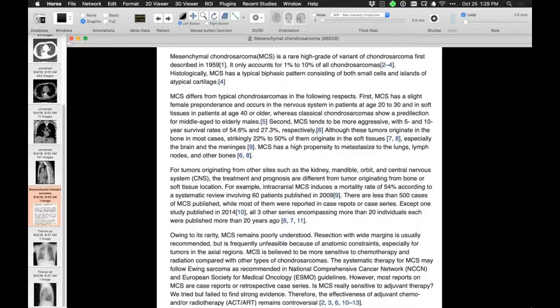A lesion that has calcified and/or ossified matrix, certainly consistent with costal cartilage matrix in a very aggressive lesion. This turns out to be a mesenchymal chondrosarcoma. We've certainly seen chondrosarcomas and other chondroid lesions in the chest, but this particular variant I don't think I've seen before. It's pretty bad, as you can see. Those are my cases.